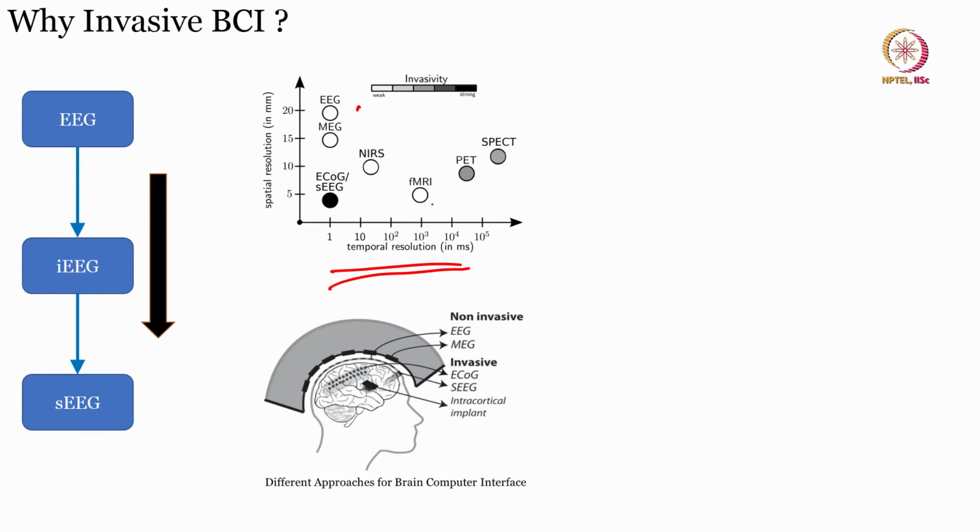What I was saying is, let us say EEG is 1, intracranial EEG is 2 and sEEG is 3. Let us compare how things will change, and it will give us an idea why we should go for this and that. So the first parameter I will consider is biopotential. All of these record biopotential, right. If I talk about the principle, biopotential, let us put some parameters of that. First is amplitude. Then let us say frequency.